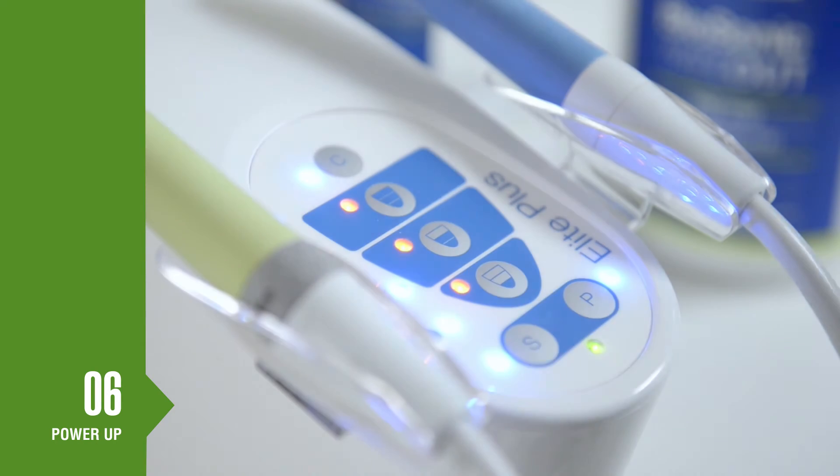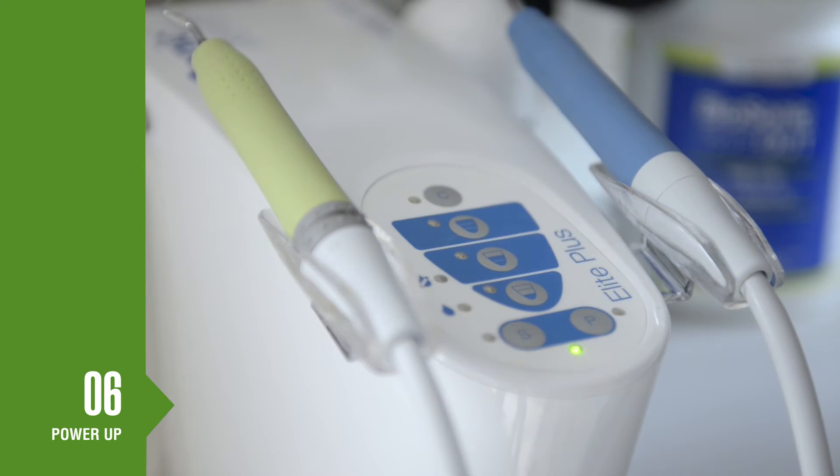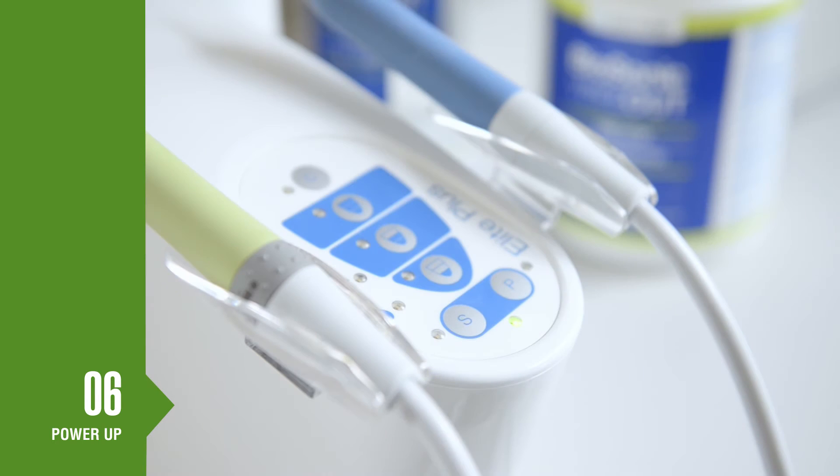All indicator lights will illuminate for a short time. The green standby light will remain on and the blue lights next to the S and P buttons will illuminate to indicate that the user should choose either the scaler or polisher mode. If five blue lights on the control panel are flashing, check that your foot pedal is properly connected. If set up properly, the unit will go into standby mode after about 20 seconds and only the green light will remain on.